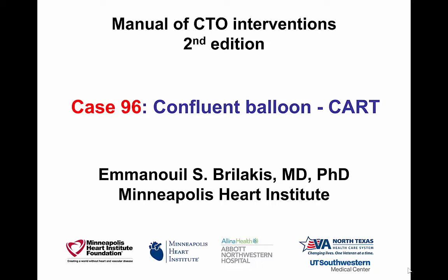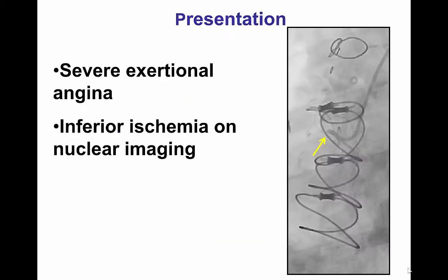Hi, this is Manos Brilakis from the Minneapolis Heart Institute presenting case 96 for the second edition of the Manual of CTO Interventions. This is a case illustrating use of the confluent balloon and the CART technique for CTO PCI.